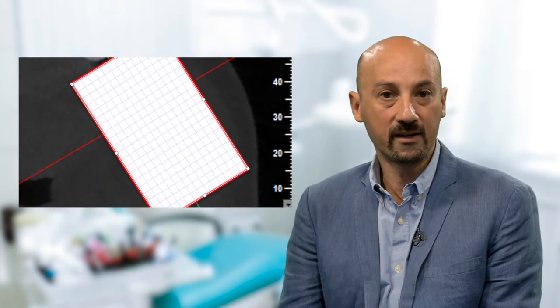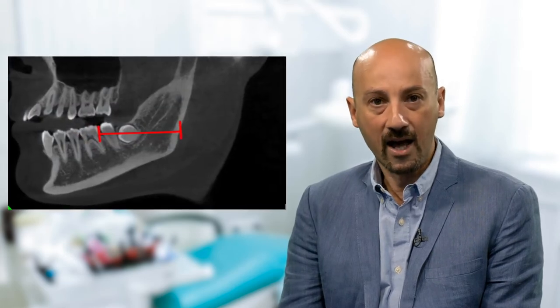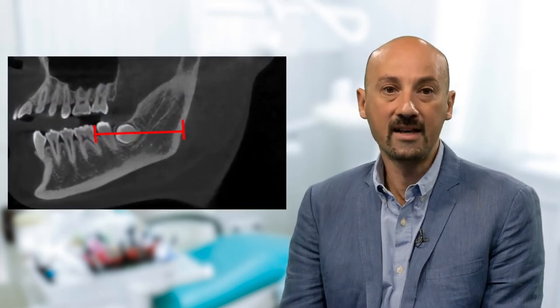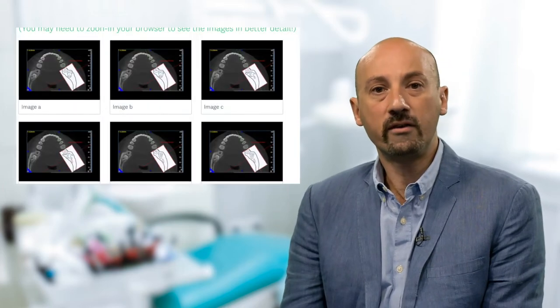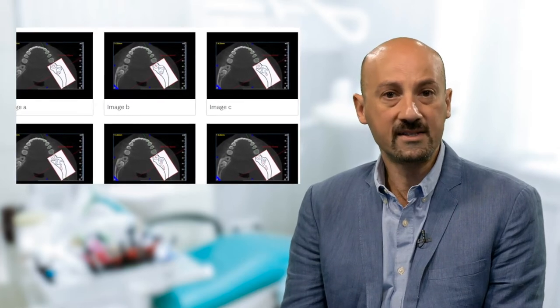This included the second molar and an impacted wisdom tooth. Now, to help us with reconstructing this, we have one vertical slice for each 2 mm of the space and the panoramic slice. The red line marks the slice that we want to reproduce. This is a simplified test as it already gives you 6 options to choose from. Maybe the easiest way to deal with such a task is to try to eliminate first the options that do not fit and then see what we are left with.